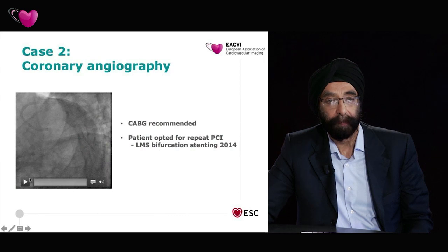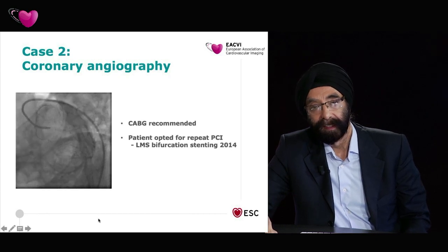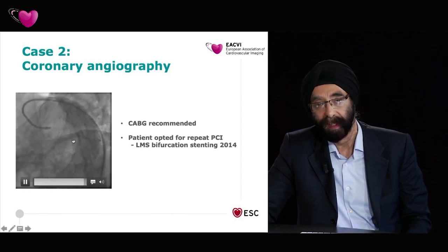This was the angiogram after the stress echo, and you see a very tight stenosis in the ostial LAD within the previously implanted stent, and actually there's also some impingement now of the ostial left circumflex artery.